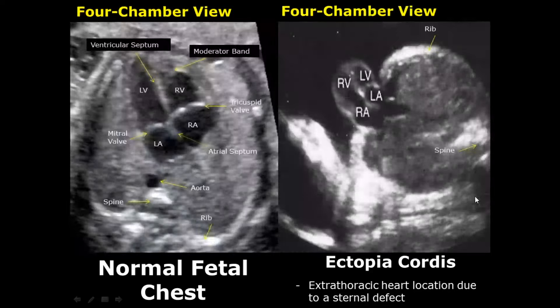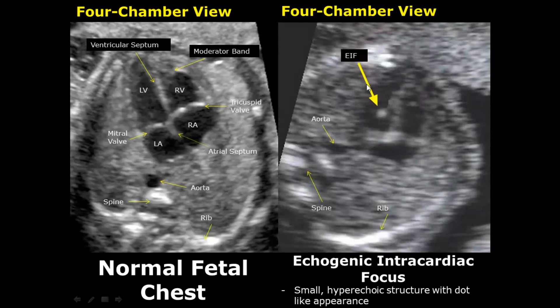Sometimes the heart may have an echogenic or hyperechoic dot-like structure present in the ventricle, attached to the interventricular septum. This is known as an echogenic intracardiac focus.